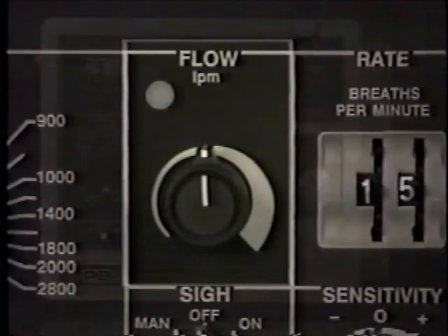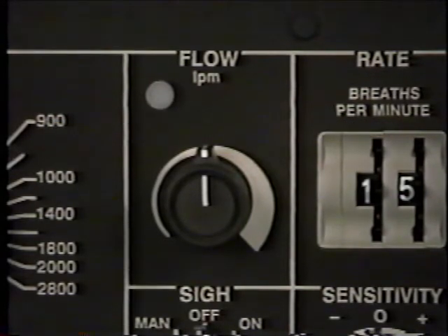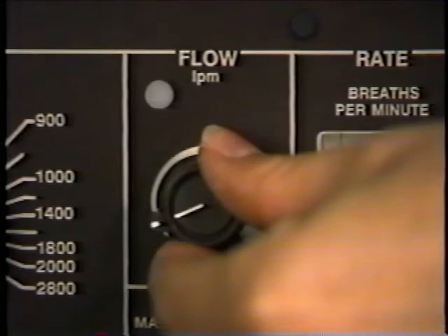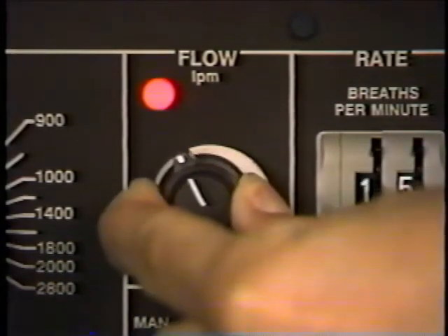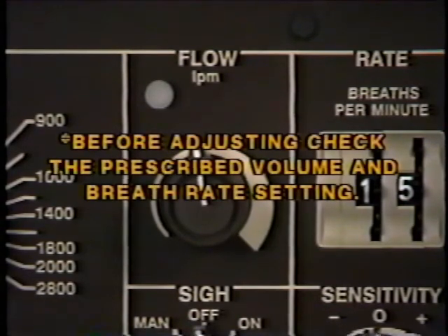The flow control is adjustable from 20 to 120 liters per minute and controls the time required to deliver a ventilator breath. If the flow control is set too low, the indicator will light and a short audible alarm will sound during each breath. When this occurs, the patient may not have adequate time to exhale. To correct this situation, increase the flow control setting to meet the patient's requirements. Note, before adjusting the flow, determine that the prescribed volume and breath rate are correctly set.